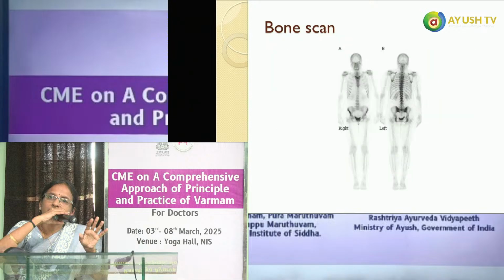So this is how a normal bone scan will be. First will be the front approach and back side. So usually எல்லா போன்ஸ்லயும் யூனிஃபார்மா இருக்கும். Pelvic axial skeleton அதாவது நம்ம pelvisலயும் spineலயும் கொஞ்சம் ஜாஸ்தியா there will be uptake of this tracer. This is how it should normally look like.